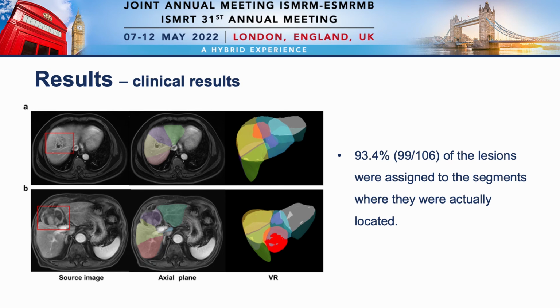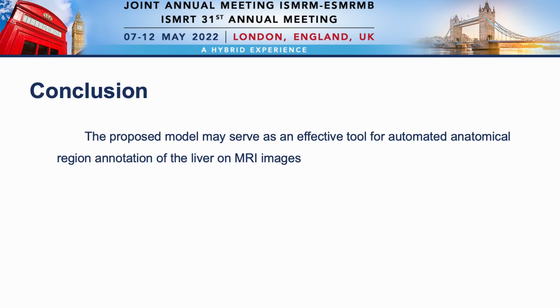The algorithm can also fail in proper segmentation, meaning in the cases with very severe vascular problems, including abnormal vascular routes or vessels that were badly invaded by tumors.